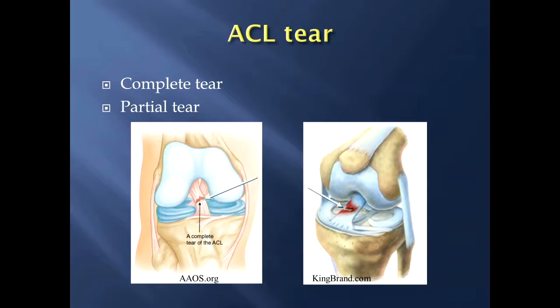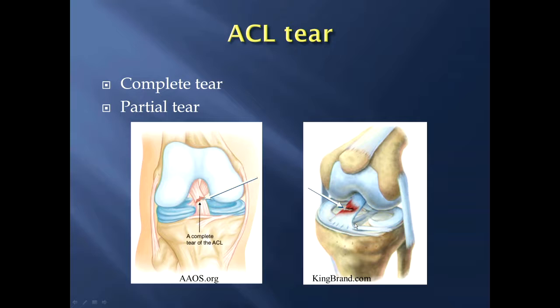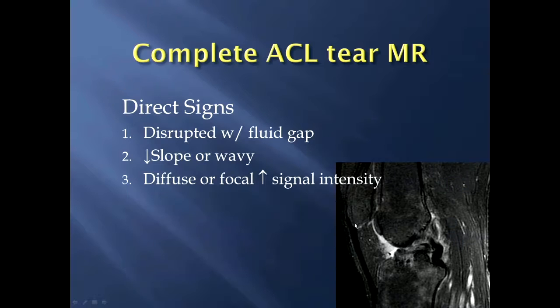The most common injury to occur to the ACL is a tear, and those are broken into two main categories: the complete tear — the more devastating one that requires surgery — and a partial tear. Here's a complete tear of the ACL, and here's another image showing a partial ACL tear.